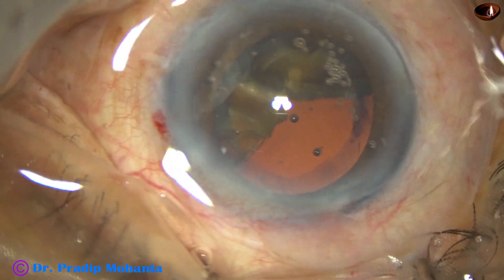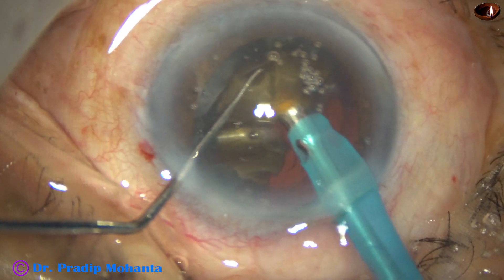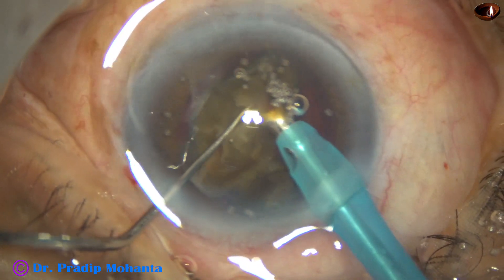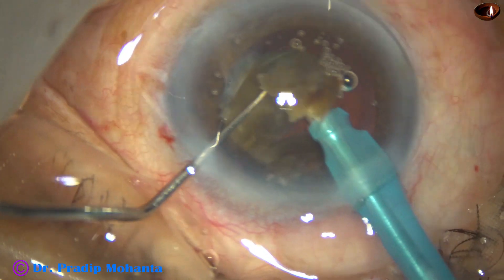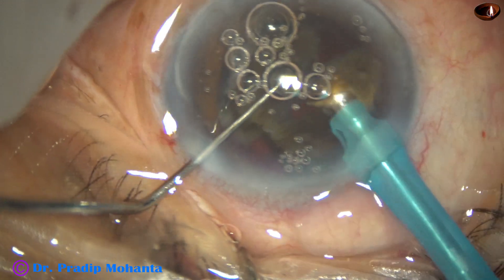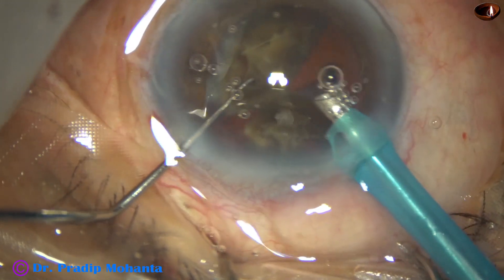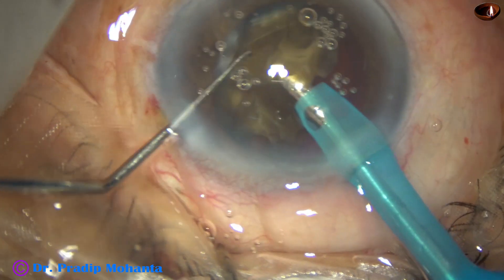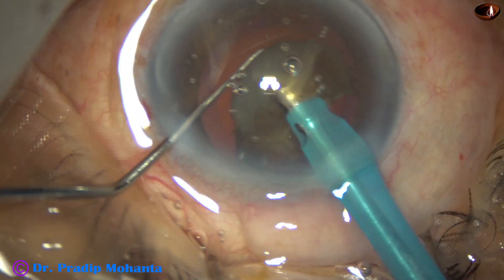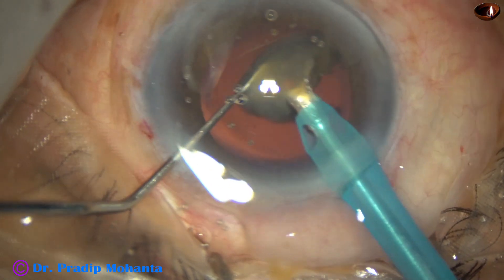Again I go in and start emulsifying the piece which is towards 6:30 o'clock. All the pieces are emulsified at the center of the anterior chamber, just in the iris plane or in the upper part of the capsular bag. Never is ultrasonic energy applied near the cornea. No ultrasonic energy is applied in the aqueous — ultrasonic energy is used only when the tip is occluded.